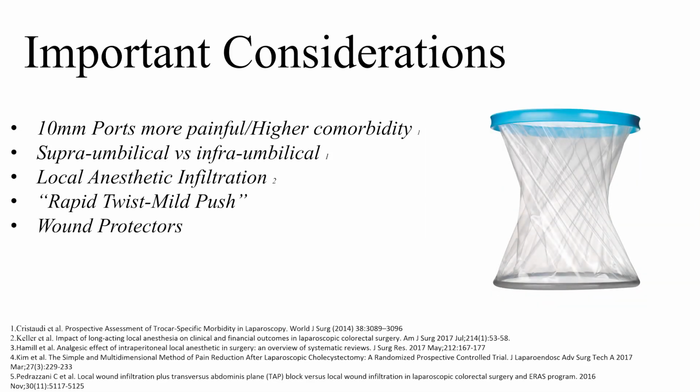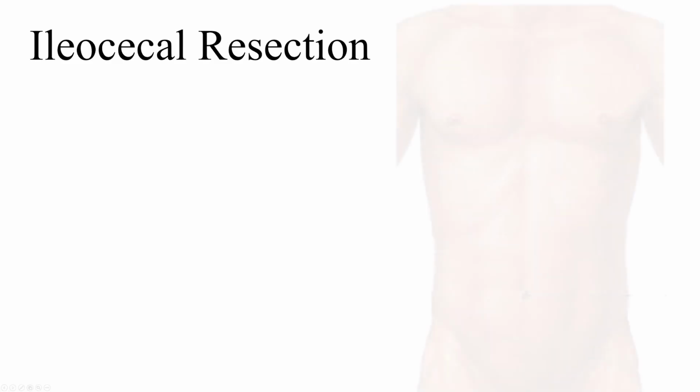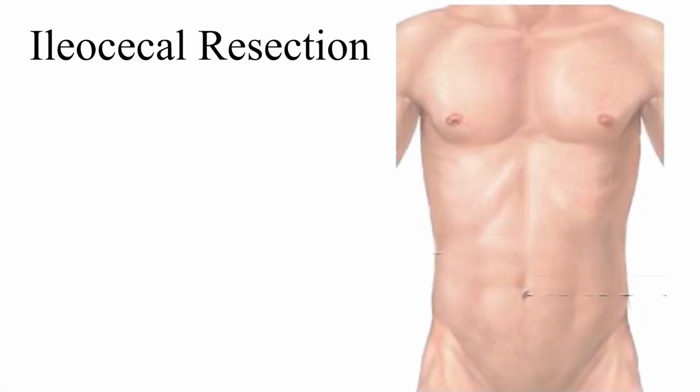And no matter what the pathology, we always use a wound protector in our extraction sites. Port setup for ileocecal resections will be described next.